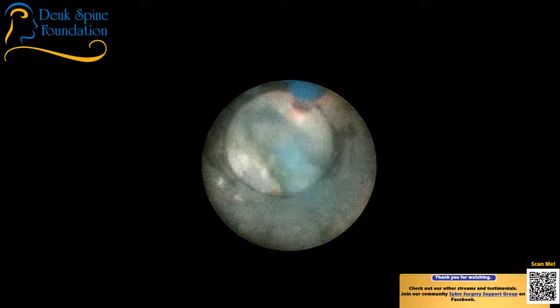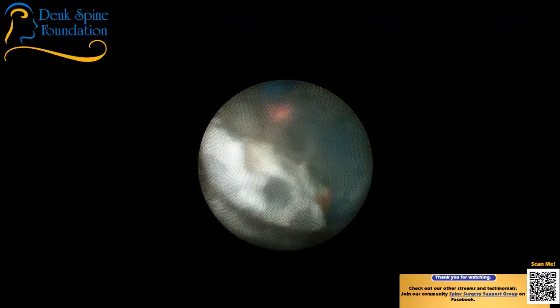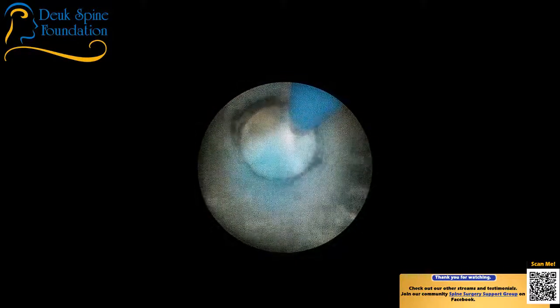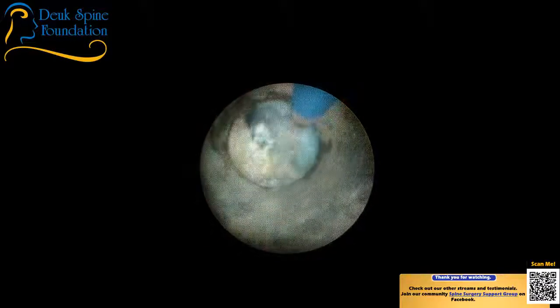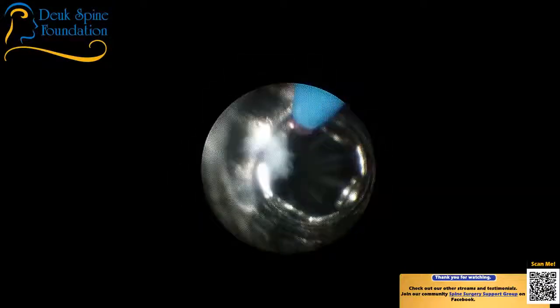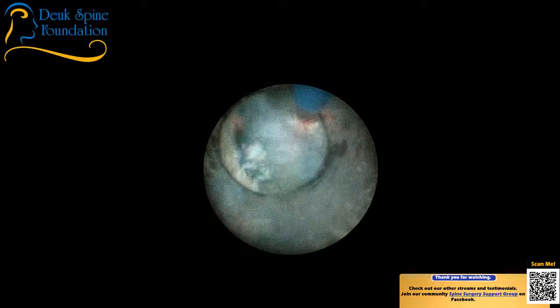And I'm not going to get crazy with it. I got rid of most of it. I'm not going to get rid of all of it. And guess what? The patient's not going to have any symptoms from it. So the goal isn't to get rid of all your bone spurs. The goal is to get rid of all your symptoms. And the problem is you get surgeons who don't understand that. And they try to gild the lily, and they end up causing complications unnecessarily.